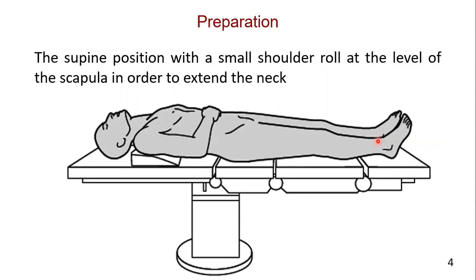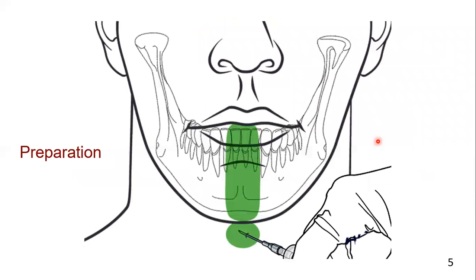The patient is placed supine with a small shoulder roll at the level of the scapula in order to extend the neck. The patient is prepared in the normal fashion and local anesthetic with a vasoconstrictor is infiltrated in the proposed incision line.